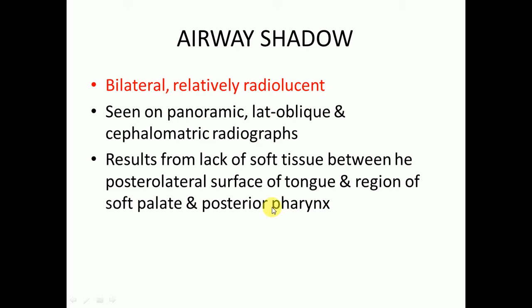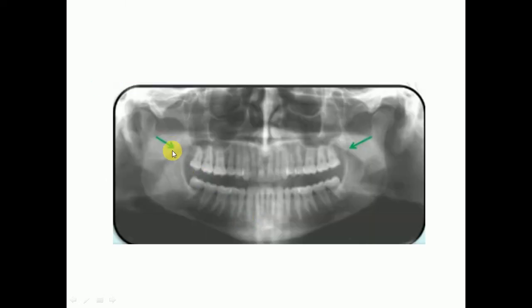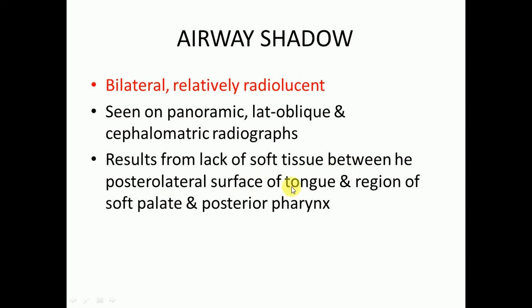First we have the airway shadow, which is present bilaterally and is a relatively radiolucent structure. It is seen on panoramic, lateral oblique, and cephalometric radiographs, and results from lack of soft tissue between the posterior lateral surface of the tongue and the region of the soft palate and posterior pharynx. You can also find shadows of the tongue here.